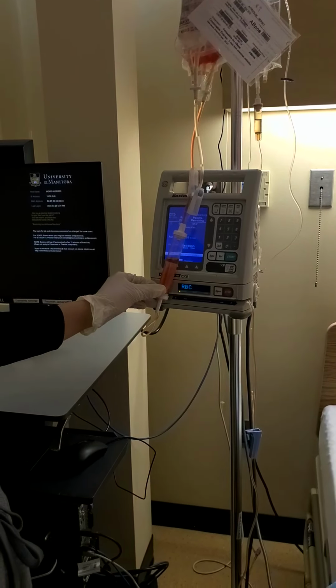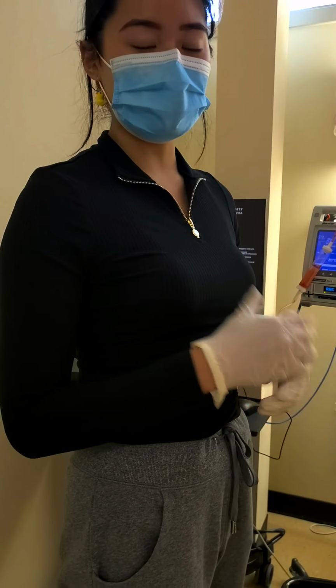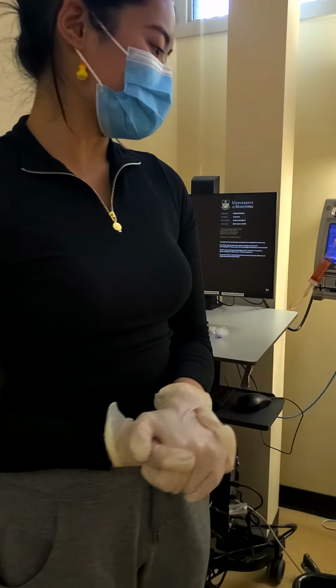Okay, Jerry, like what I've said before, I'm going to be here for 15 minutes. We're going to monitor for any signs of reactions that you may have. And if you have any, make sure you ring your call bell. And like I said, I'll be taking your vital signs throughout. We've talked about that before. So I'm going to do a safety check of the room, lower the bed, make sure the call bell is there. And then after that 15 minutes, we're going to be changing the rate to 197 mils per hour. And then I'm going to go out, document, sign with my nurse to post it. Yeah, that's it.